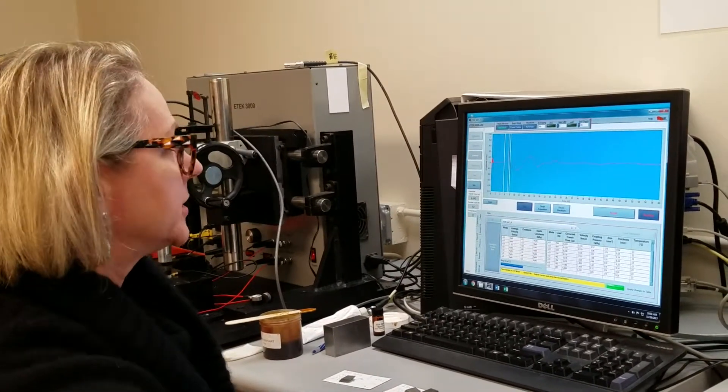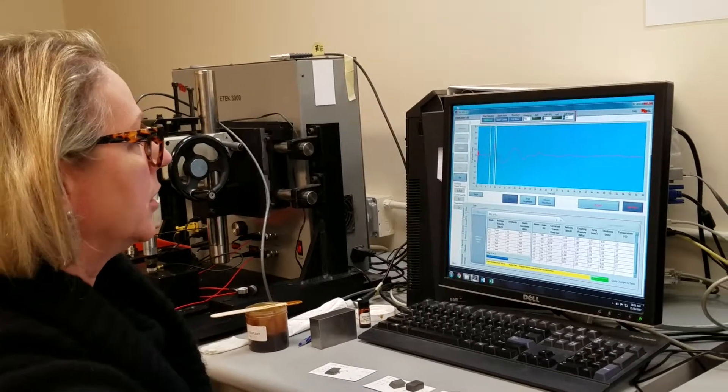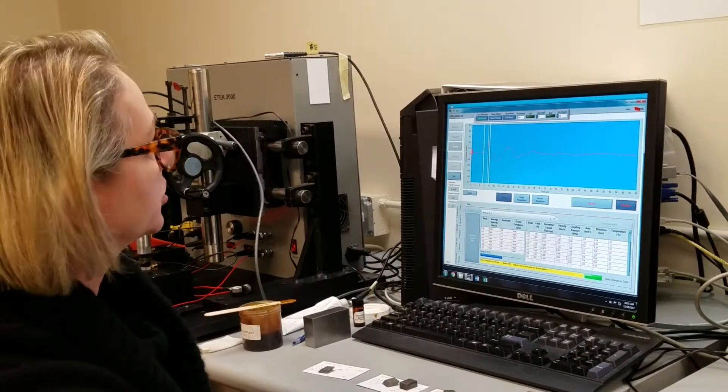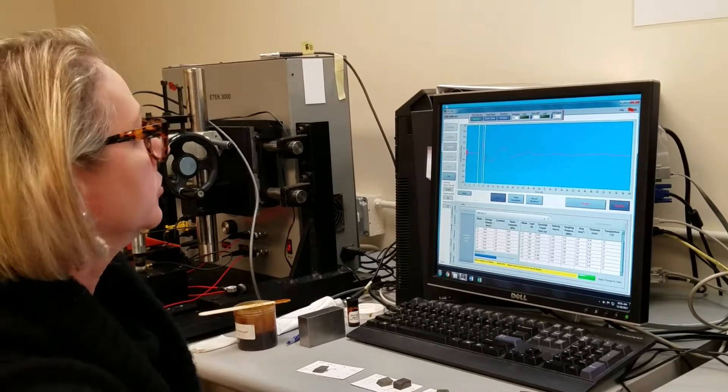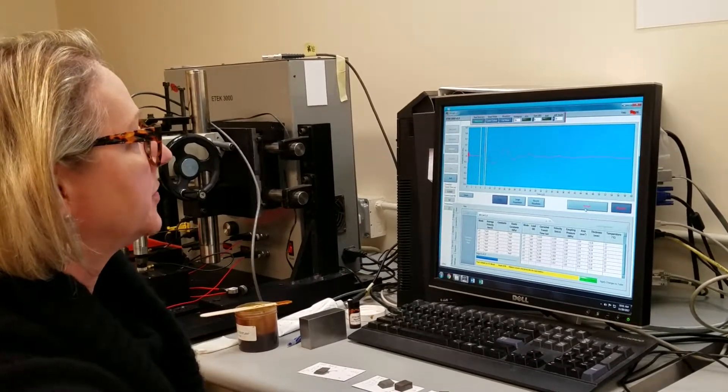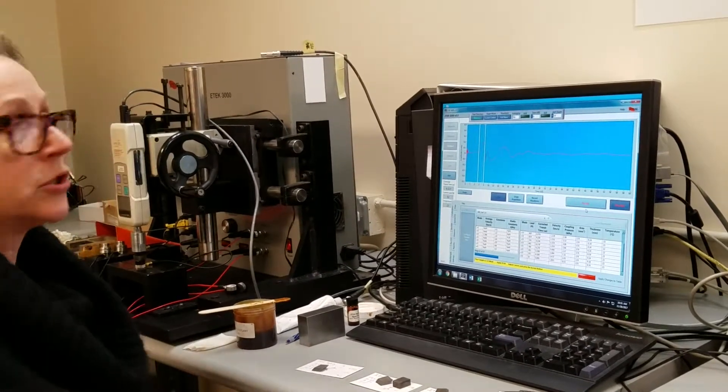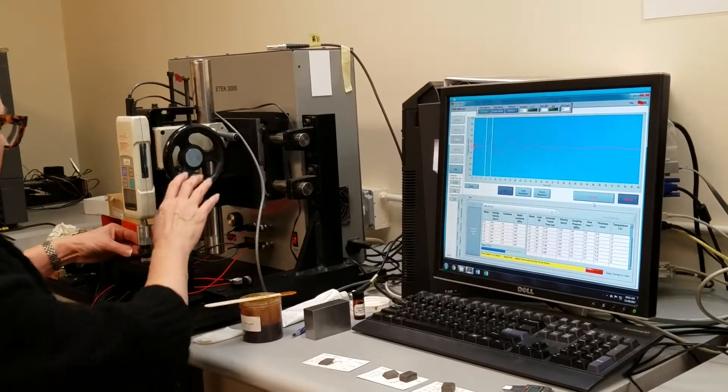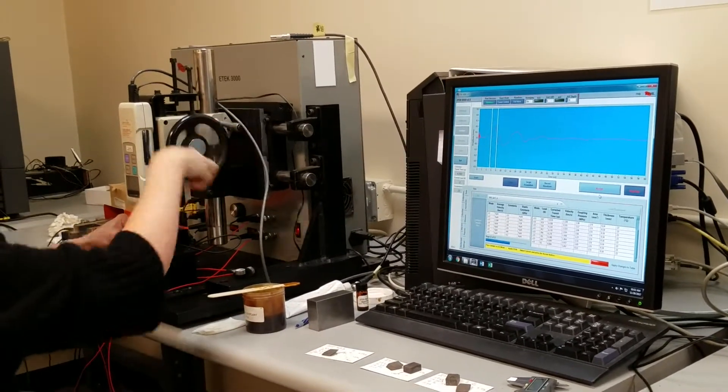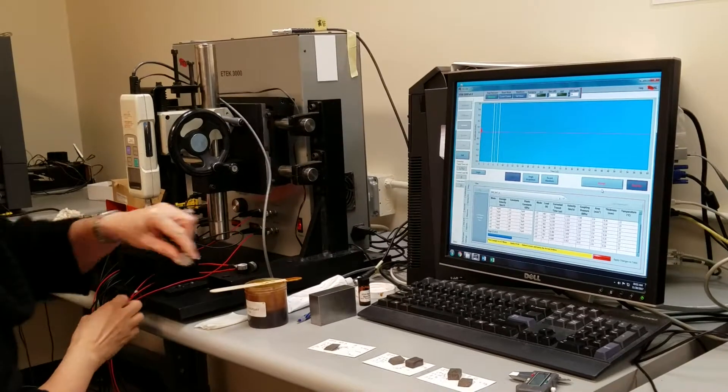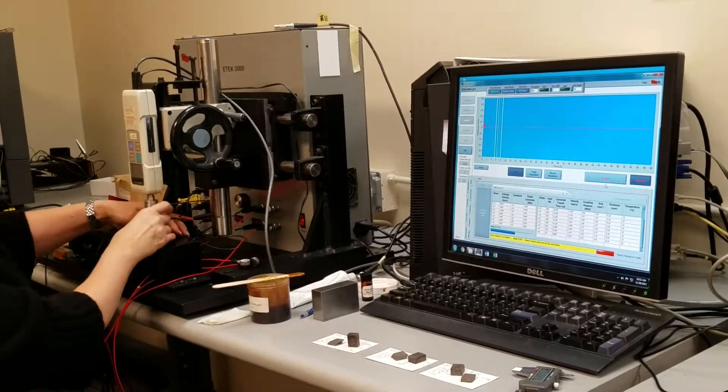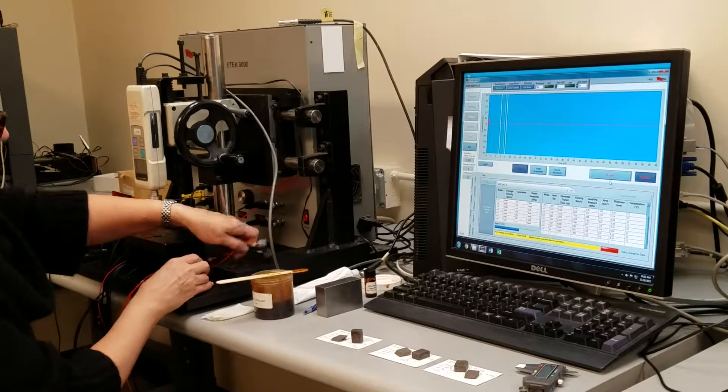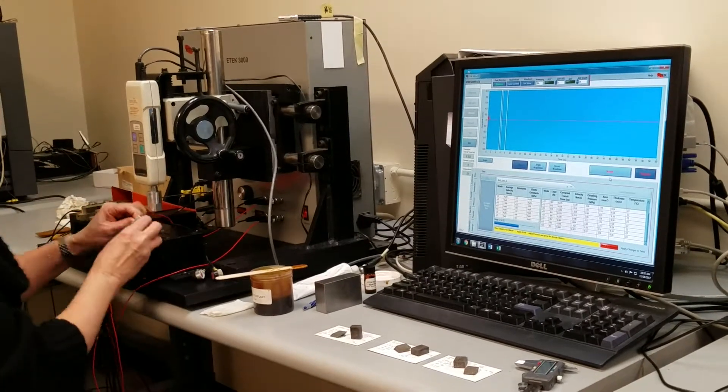The last measurement for the load with the compressional transducers says apply 87 newtons. I will click accept, and then we are ready to start with the shear wave load measurement. I will raise the sensors, set my sample aside, unscrew the sensors, and replace with the shear wave sensors.